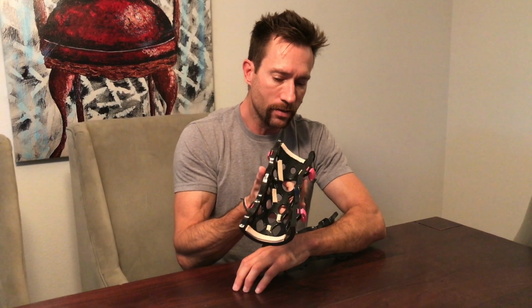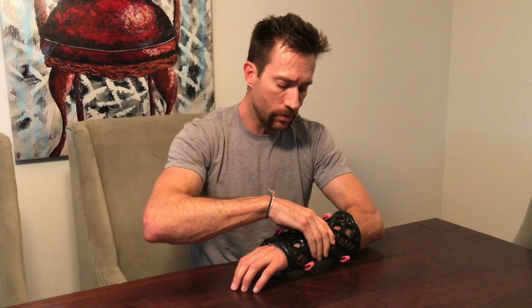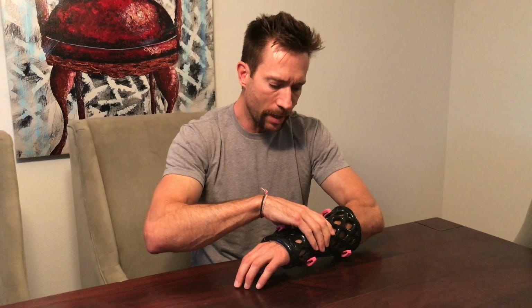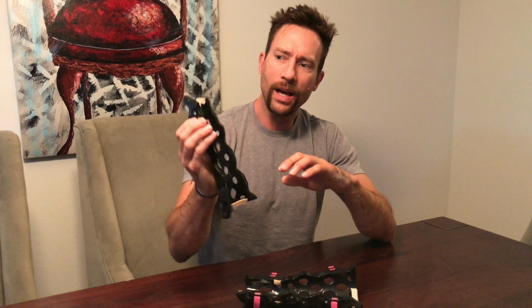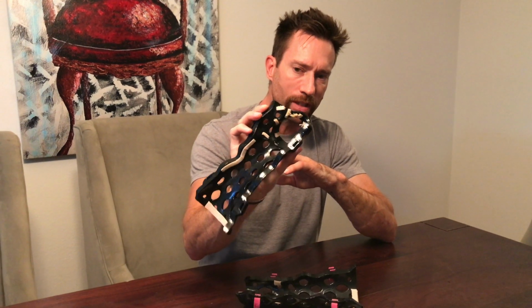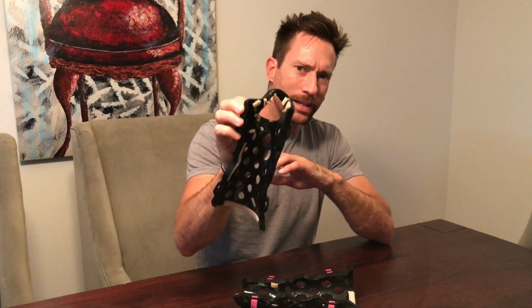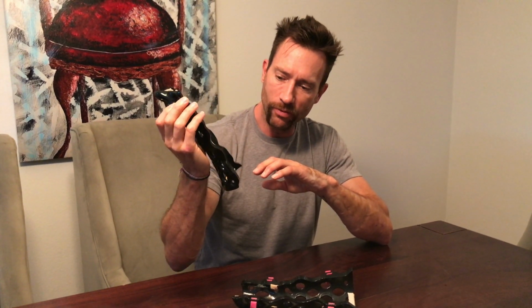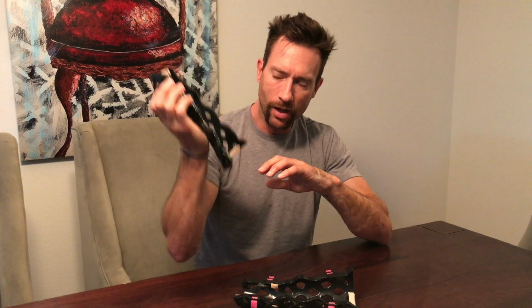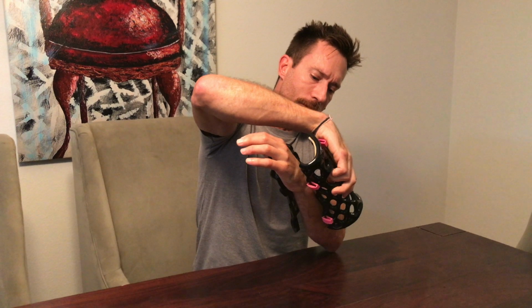So to fix that, I've put in these moleskins that you can see, and they're great. They are nice and soft, so it's against my arm is really good. And this is the more important piece because this is what holds your thumb in place. And I've just put these little tabs. You just cut little moleskin tabs and place them where you find that you've got a little bit of space, and it's good. It helps take up any extra volume that's there. You can see that down on the cuff. And it really secures the arm in there very nicely.